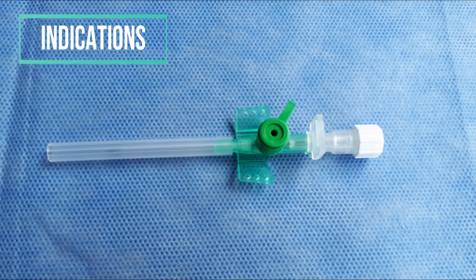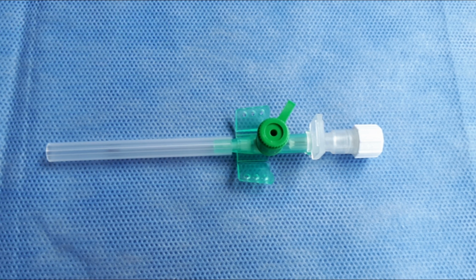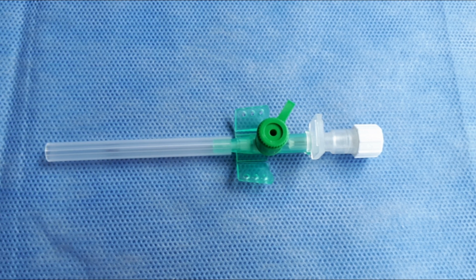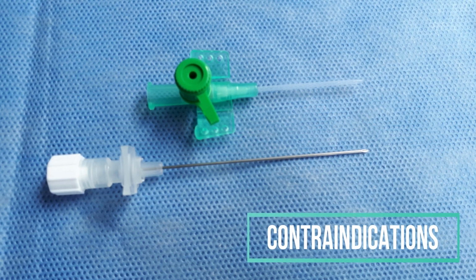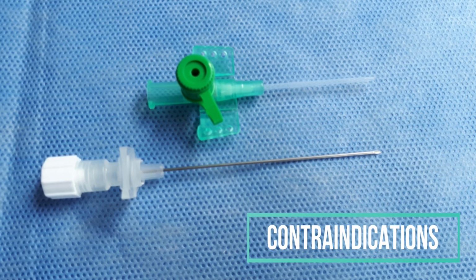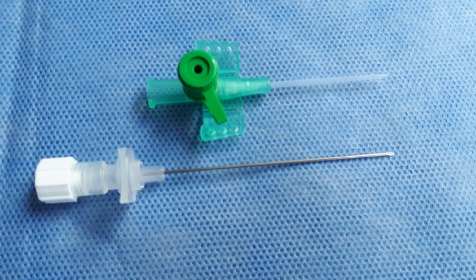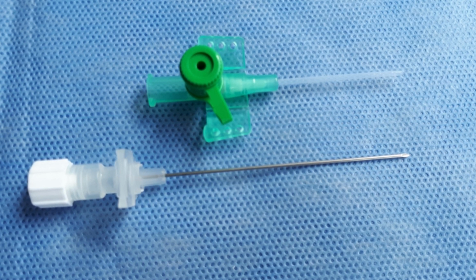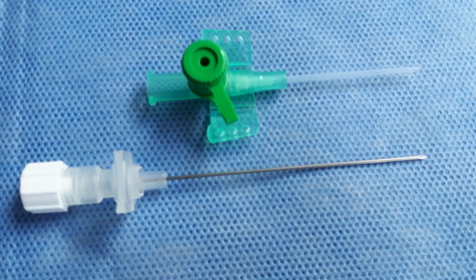The indications for IV cannulation include repeated blood sampling, IV administration of fluid and medication, IV nutritional support, and IV administration of blood and blood products. There is no absolute contraindication for IV cannulation, but there are relative contraindications, that is, to avoid extremities that have massive edema, burn, or an injury. In that case, try to access the other side.